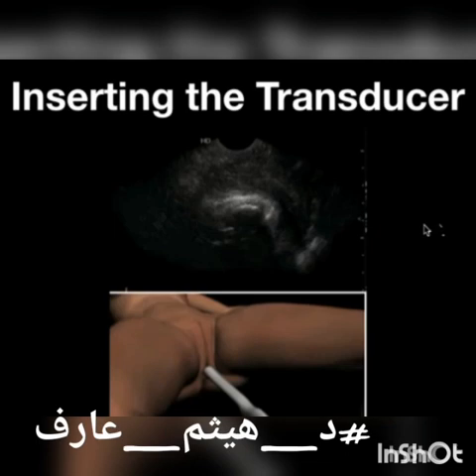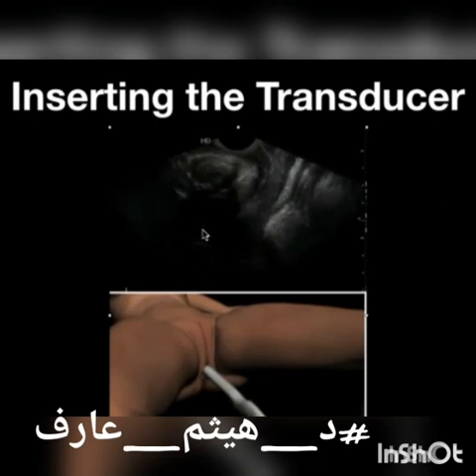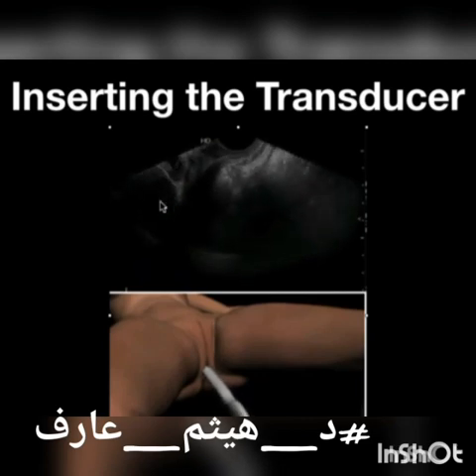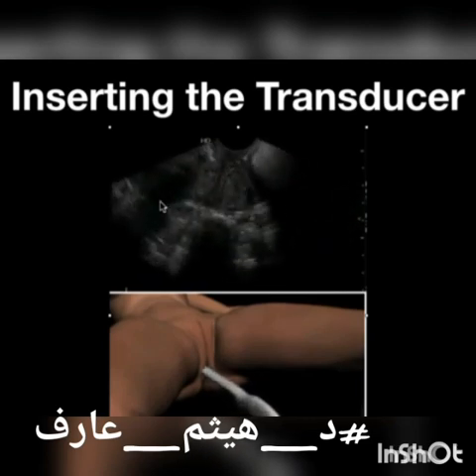When you insert the transducer, you want to make sure you start watching the screen the minute you insert the transducer, and you're going to start looking for landmarks. The first thing that you may see when you go in is going to be the urinary bladder. You're going to next attempt to find the cervix in the lower uterine segment, which you're seeing right here. You would then need to adjust your depth as needed. You can see here is cervix and lower uterine segment. Here you've got the uterine fundus. You can see some of the endometrial stripe here.